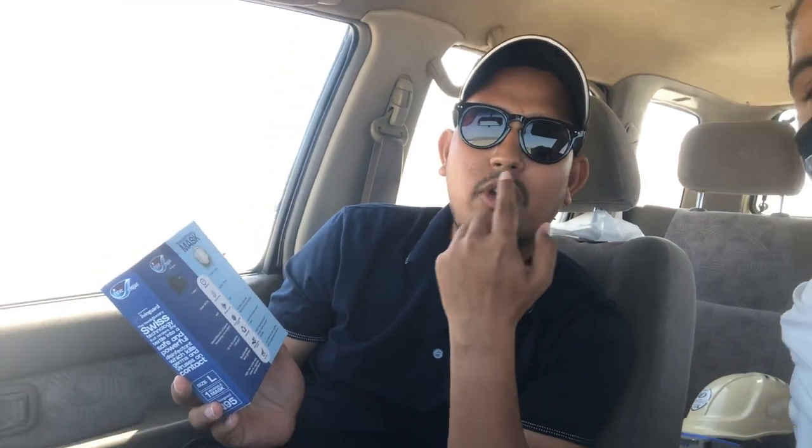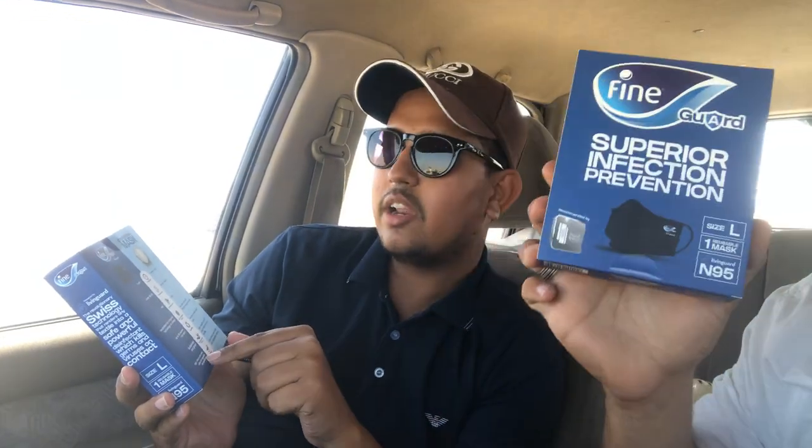The last feature is the one-way valve. Sometimes you feel heat and steam around your mouth with regular masks. With this mask, you will not feel that. So this is a really good feature.